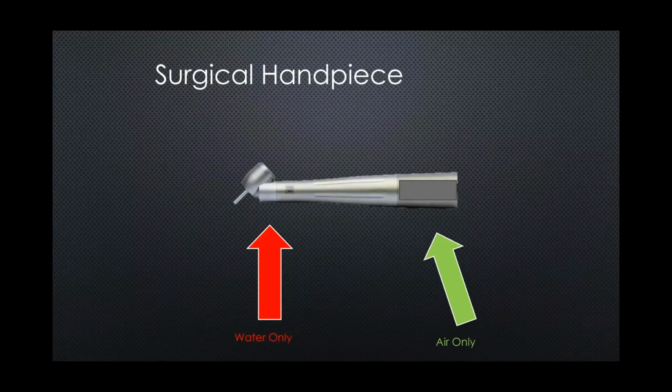You can buy them overseas. You can buy them from reputable companies. They run the gamut in price. Be really careful of knockoffs, because you want to make sure that you have a surgical handpiece.